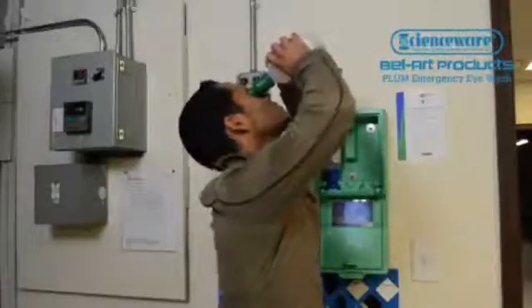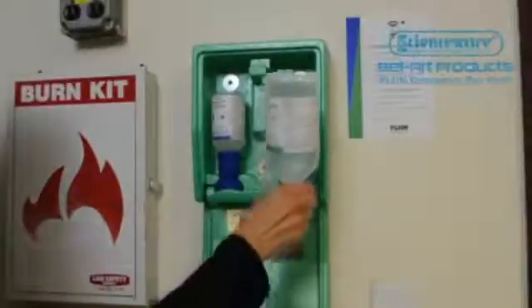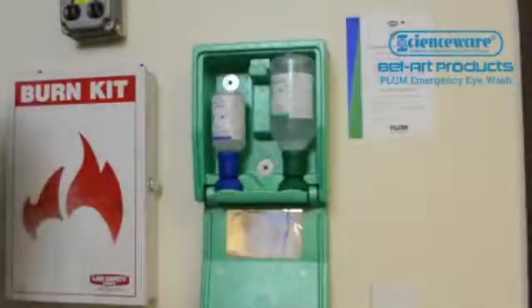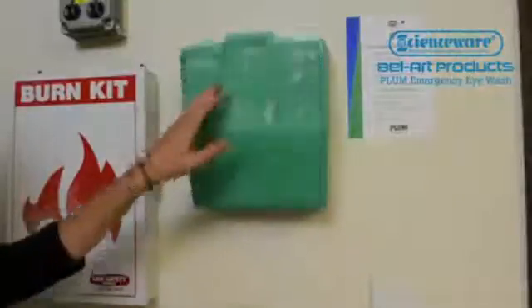Plum Eyewash can be dispensed when upright or inverted, allowing use while standing or lying down. Replacing the used eyewash bottle with a new one is quick and easy.